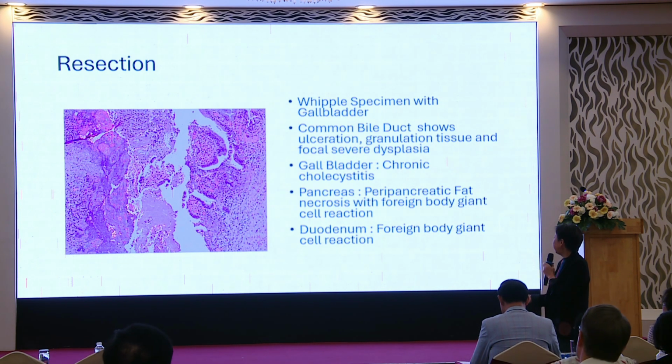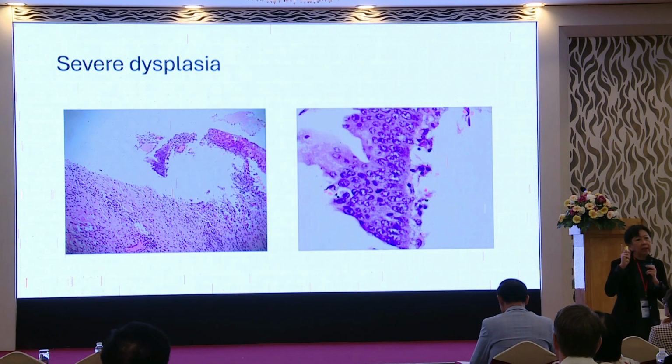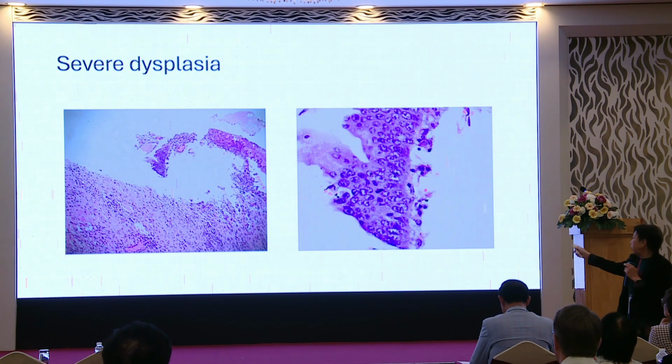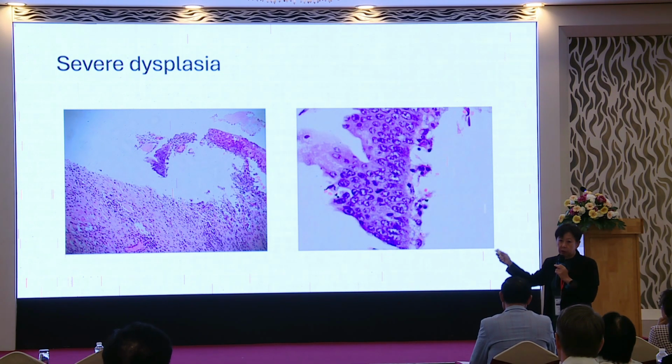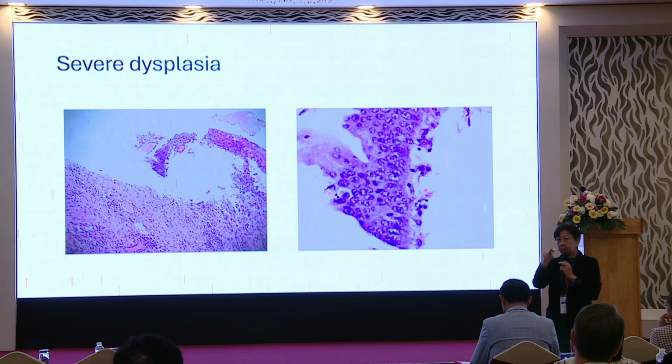So after processing the whole thing, we found one little strip, which could account for the cells that we saw. Now, if I go back to the cells that I showed you just now, you will note that the nuclear membrane was rounded, and if we had divided it into 4 quadrants, each quadrant would look almost the same.